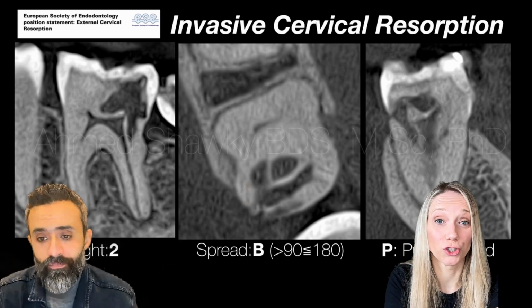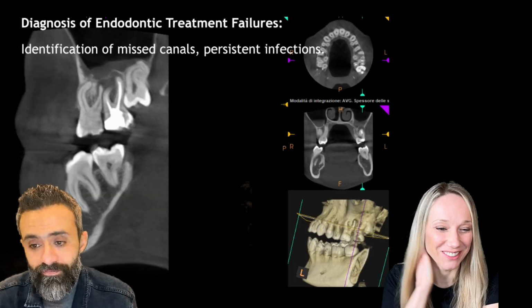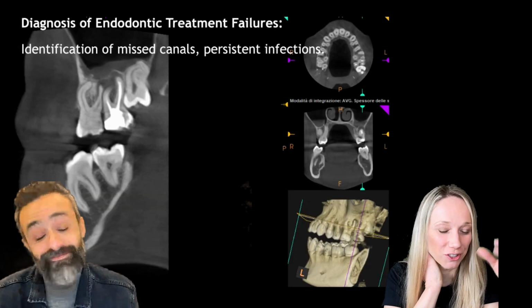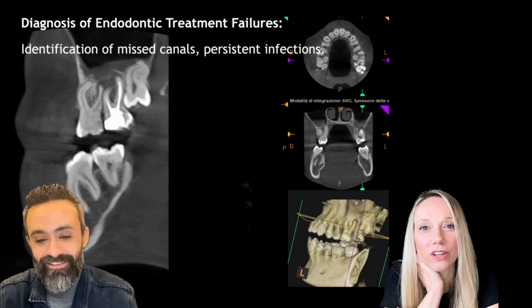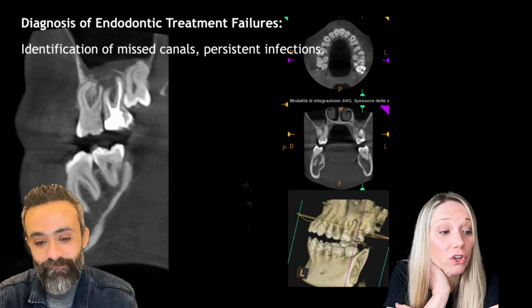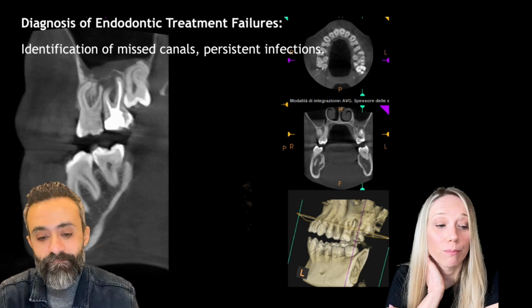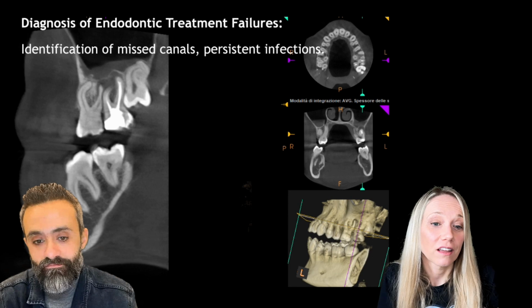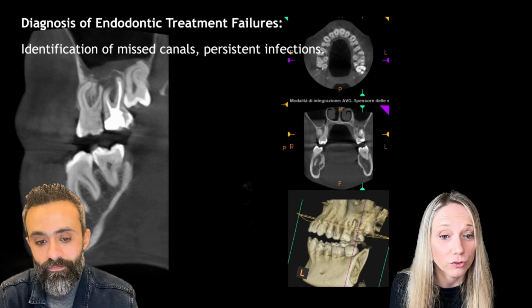Yeah, because of course you don't want to try and see what happens without having some certainty about the outcome. So I do completely agree. And of course we don't have to forget one very common indication, that is the evaluation of a previously treated tooth that has been unsuccessful.